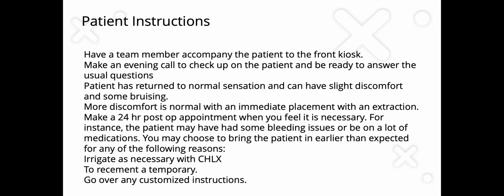More discomfort is normal with an immediate placement with an extraction, okay? Make a 24-hour post-op appointment when you feel it is necessary. For instance, the patient may have had some bleeding issues or be on a lot of medications, or you may choose to bring in the patient earlier than expected when you question oral hygiene or to re-cement a temporary, if you feel like it might have been dislodged. So you want to irrigate with chlorhexidine. You want to re-cement the temporary for the patient, and then go over any of the customized instructions.